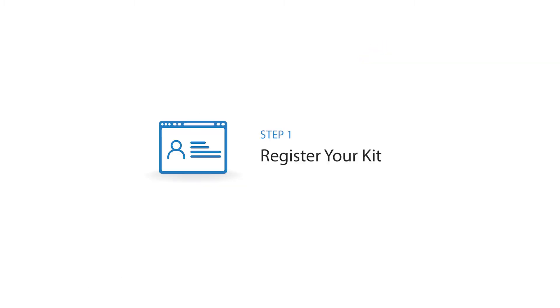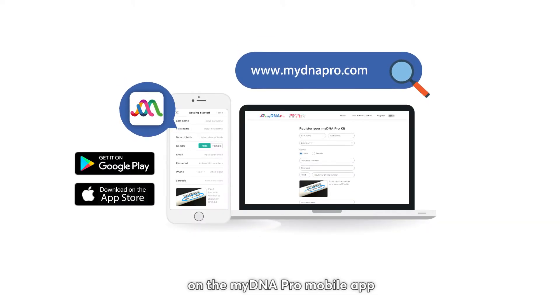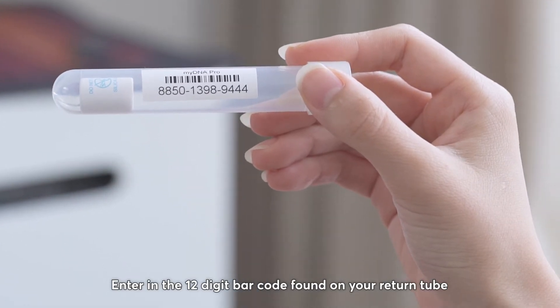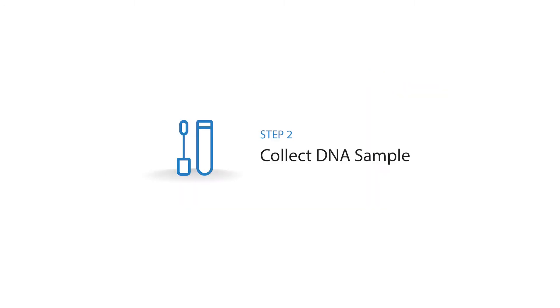Step 1: Register your kit. Register your kit and fill in the lifestyle assessment questions on the MyDNA Pro mobile app or online at www.mydnapro.com. Enter in the 12-digit barcode found on your return tube. Please note that samples received will not be processed without registration.